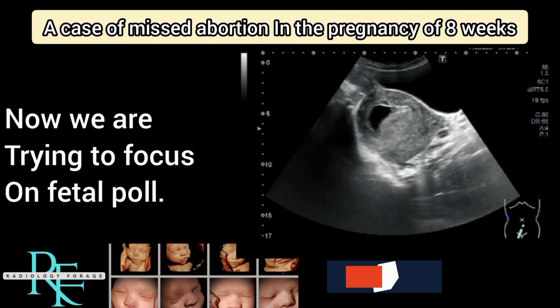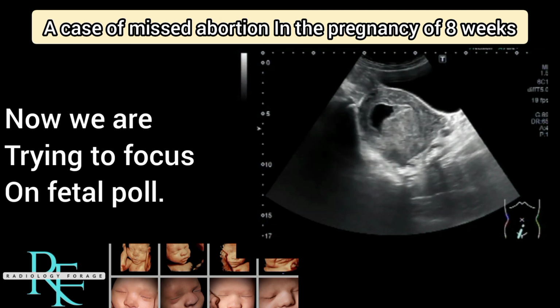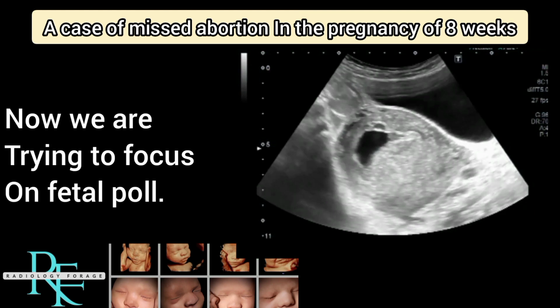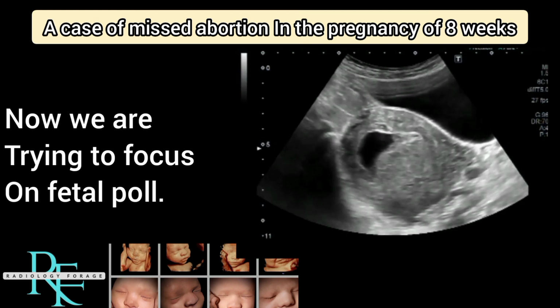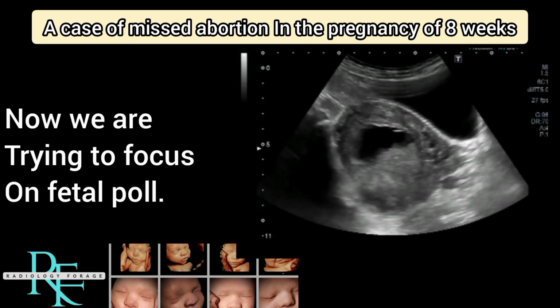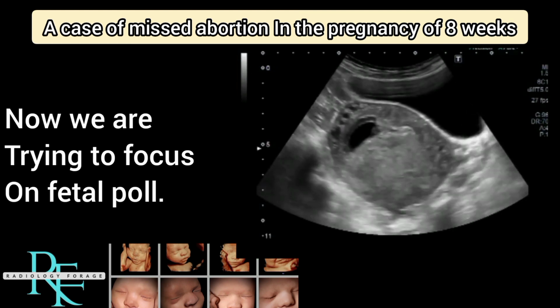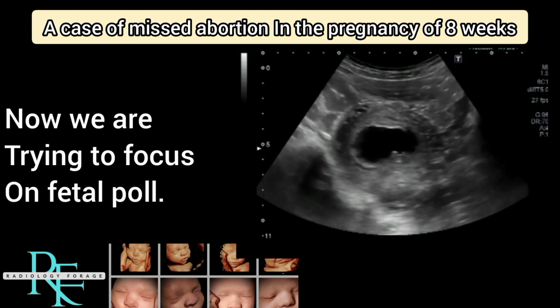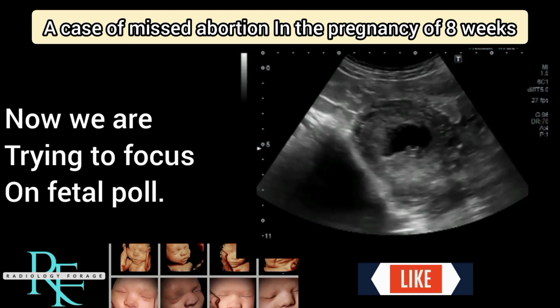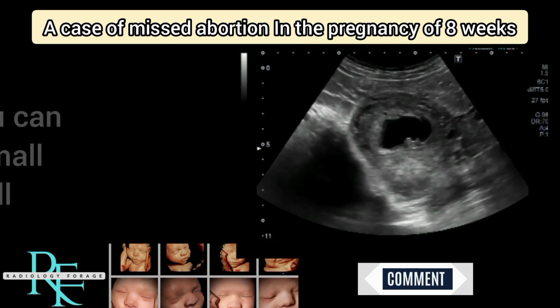Here you can see now we are trying to focus on fetal pole in the gestational sac. You can see it very clearly. There is a small fetal pole in this gestational sac.